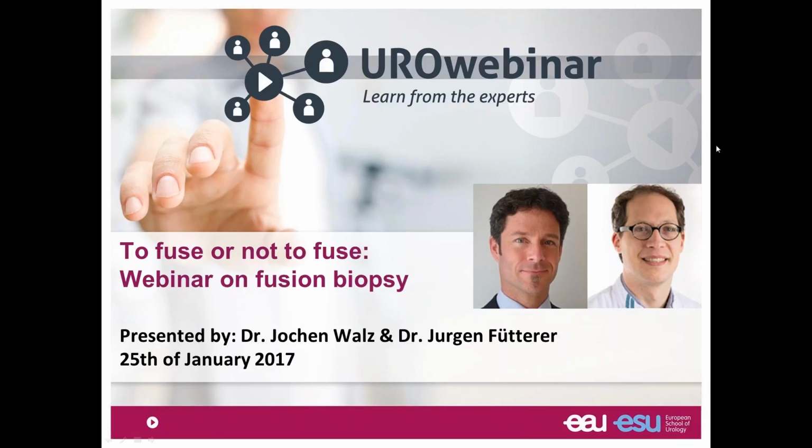My answer to this depends very much on how confident you are with your MR data. If you're very familiar with it and you did your own validation studies, you had a look at what the negative predictive value of your MR is, and if that is really high, then you might only go for targeted biopsies. But I would state for the time being that this is only the case in very few experienced centers. Nijmegen, of course, is part of that.